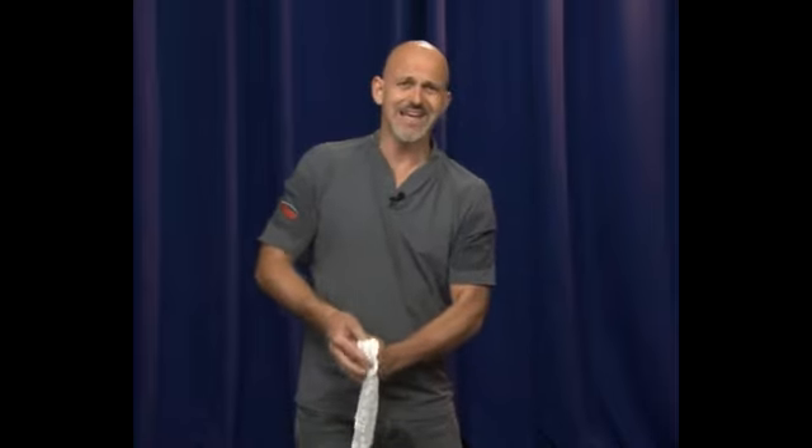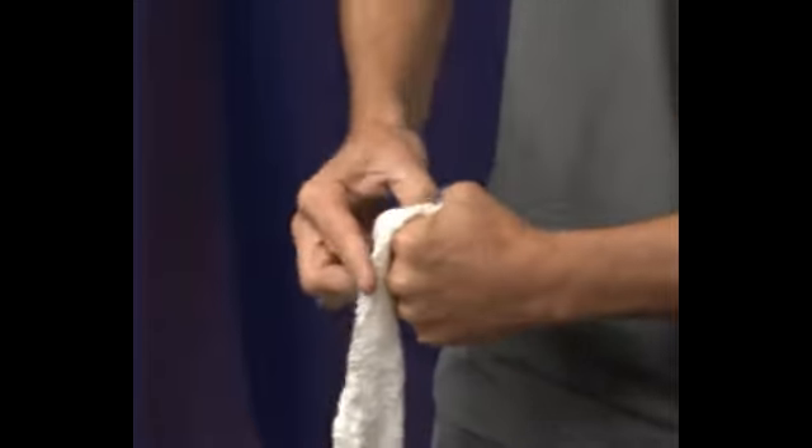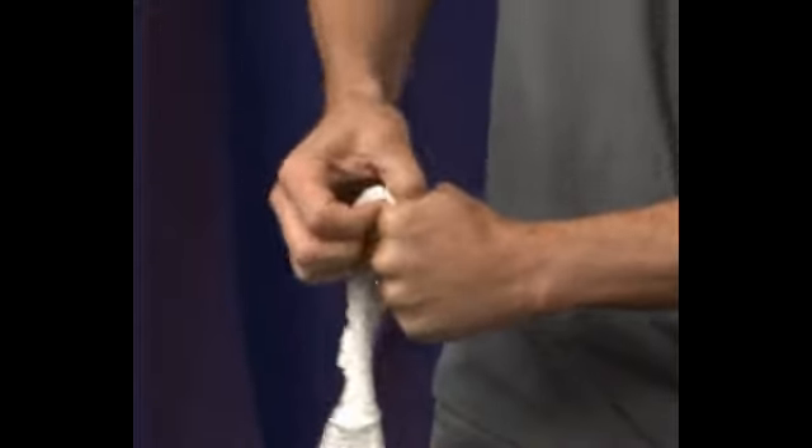Again, to stop the blood — to get as much pressure as we can inside so that the blood isn't coming out. Continuing to pack, when it really starts to get hard at the top, and you can see I'm still clenching my fist closed here, not really much movement on the fingers.